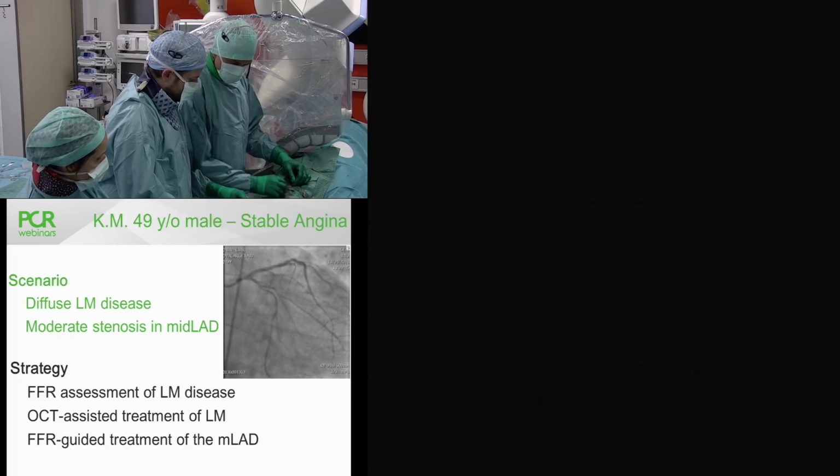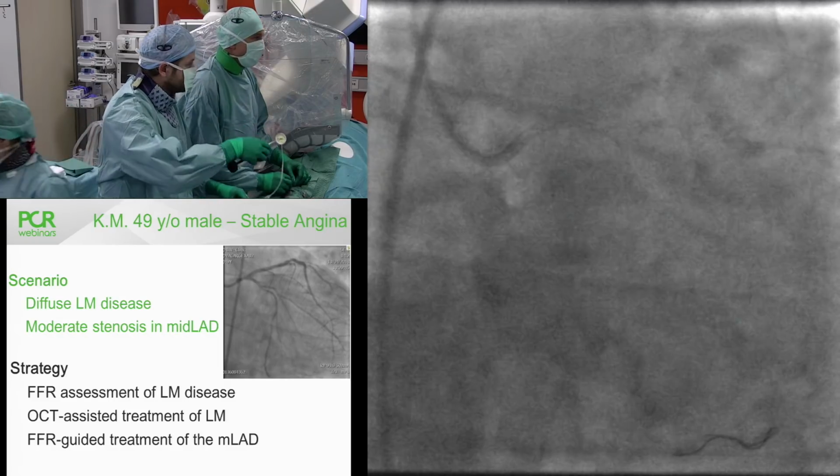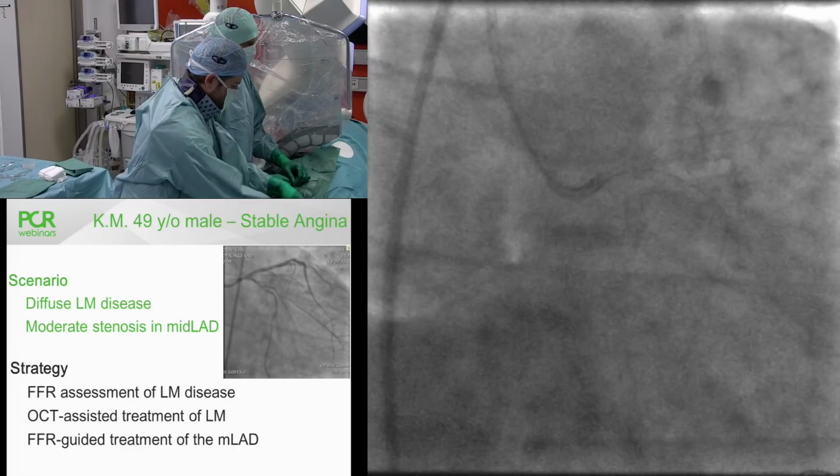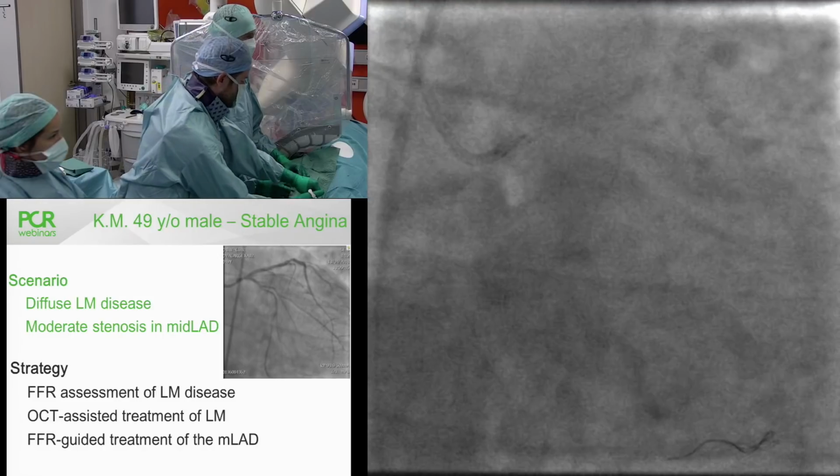You can stay in this projection, Katja. Oh, I made a kink in the wire. Not good.